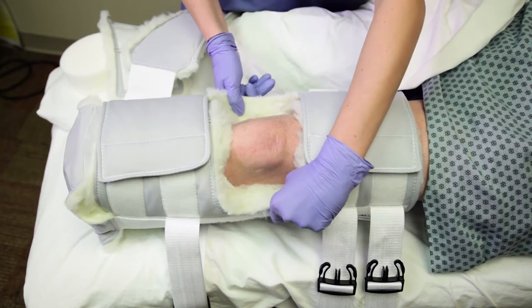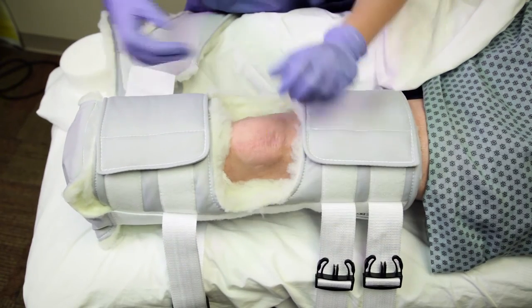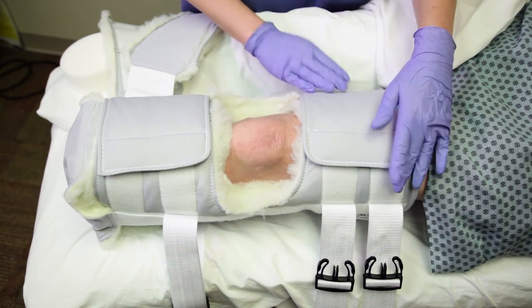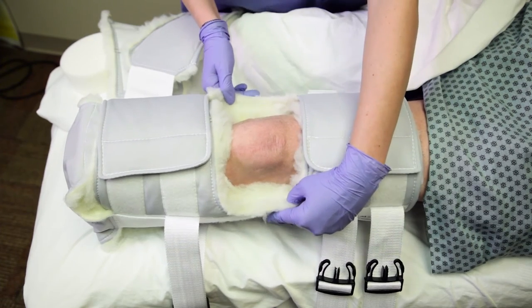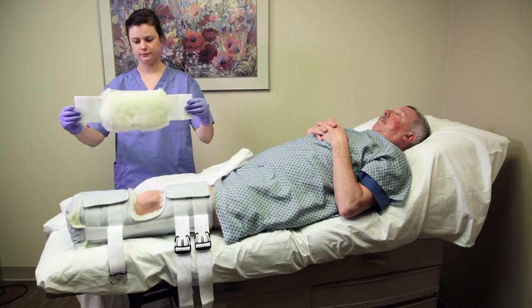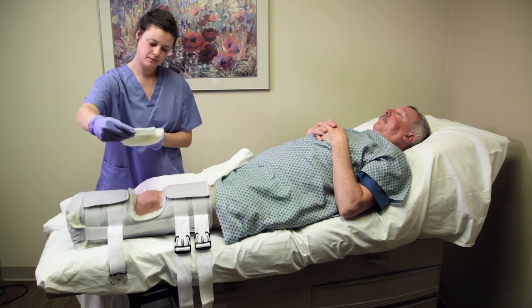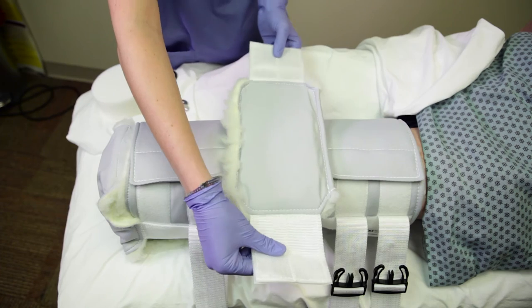You should now see the patient's patella located directly in the patella window. Adjust the dressing as needed until the patella is located squarely in the patella window. Then hold the patella pad with both hands on either side and bring it down directly over the patella.